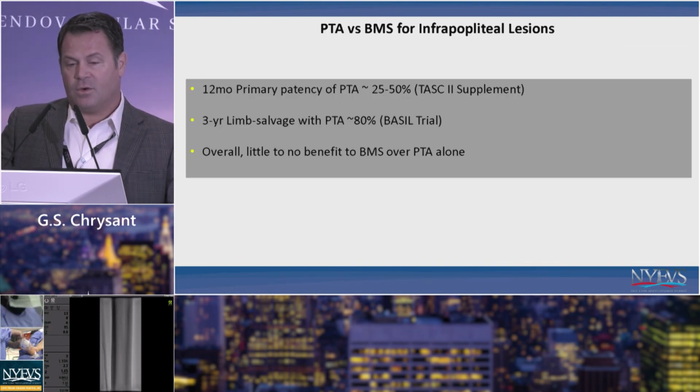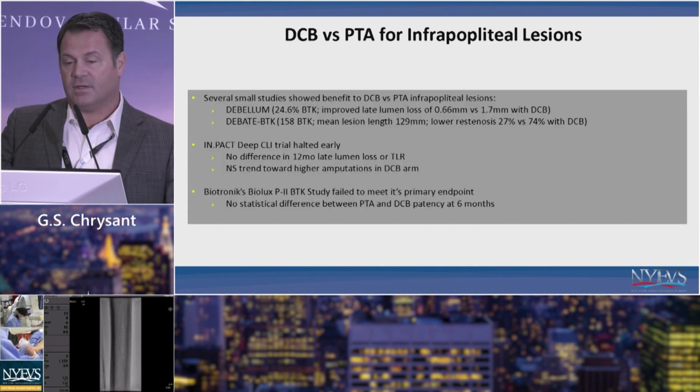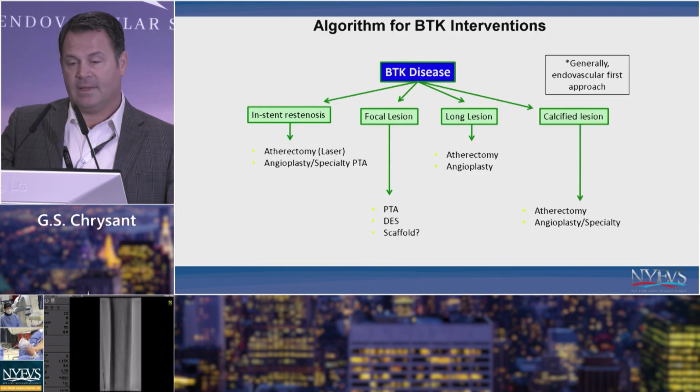In terms of just quickly looking at some of the other tools in the toolbox, PTA and bare metal stenting has been kind of suboptimal. You look at coronary DES, it's much better. And again, BVS we don't know about, and then DCB, obviously we're all familiar with these trials that simply didn't work out as well as we would have liked.